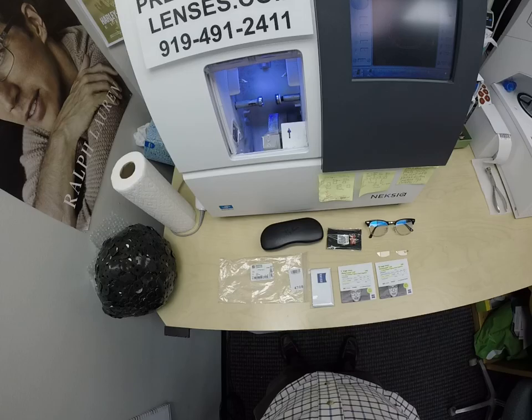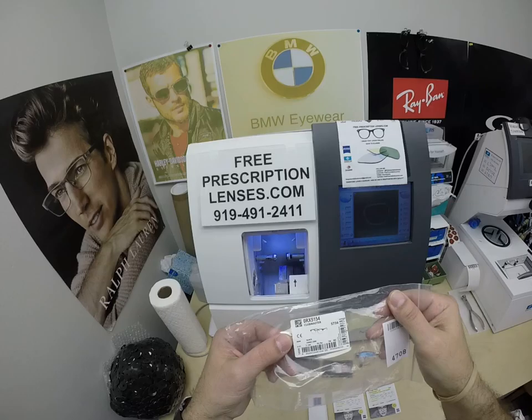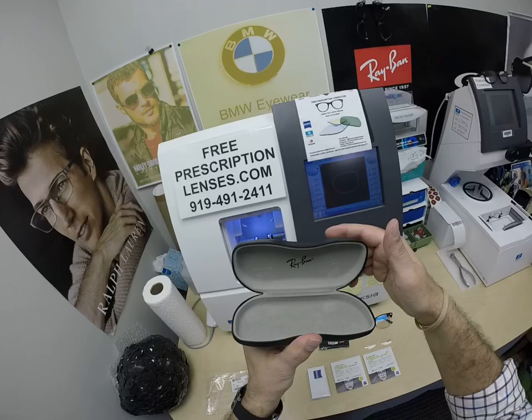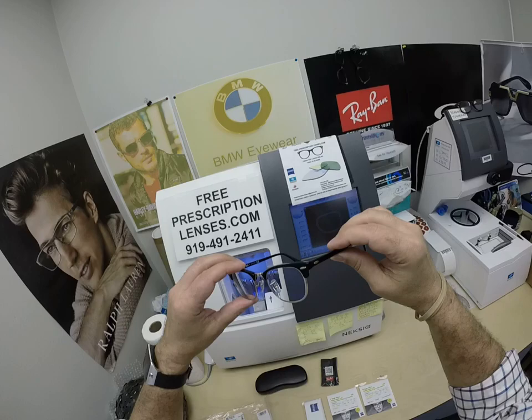I want to show you Mark's Ray-Ban 5154. This is the Ophthalmic Clubmaster, color 2000, the classic shiny black in the 51 eye size. The Ophthalmic Ray-Ban frame comes with the hard shell Ray-Ban case, the Ray-Ban cleaning cloth, the original demo lenses, and this is the star of the show — the main attraction.